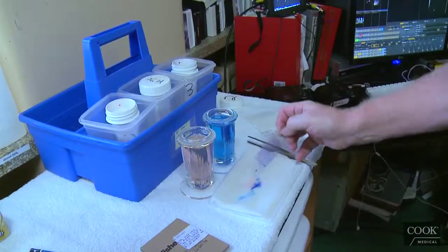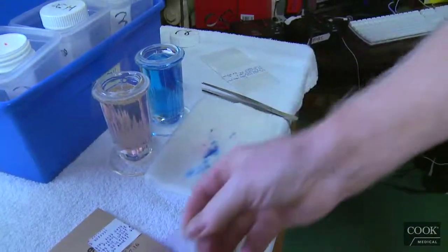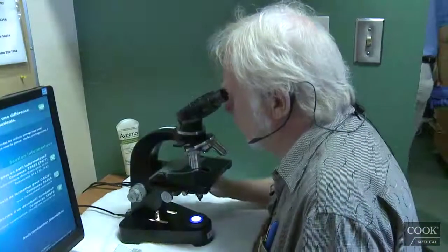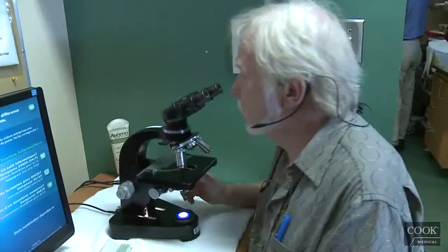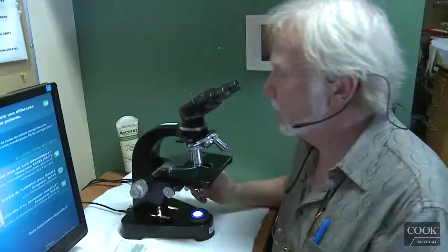So now we can look at the slide. The slide is very well stained. You see, it's bluish material, so you can see here it's blue. So it means there's a lot of cells when it's blue. As you can see, it's pretty fast. Smear is good. Cells are very well preserved, well stained, and obviously malignant. It's a non-small cell carcinoma.